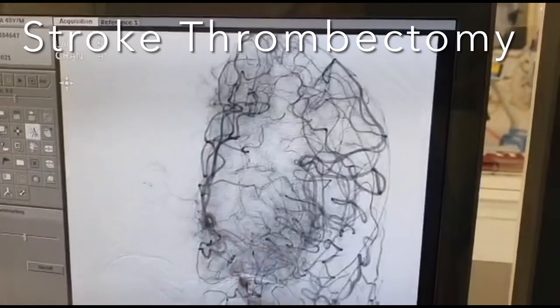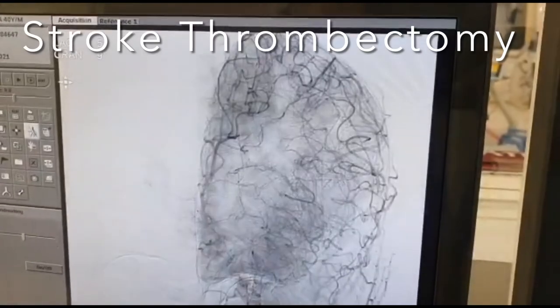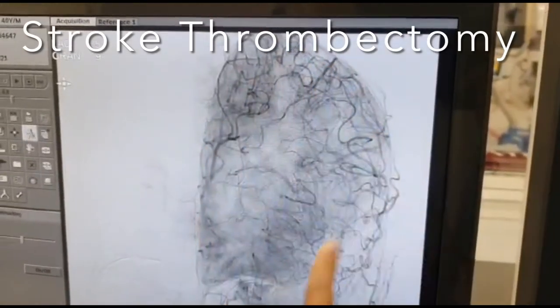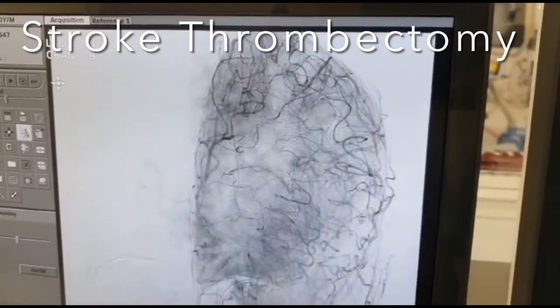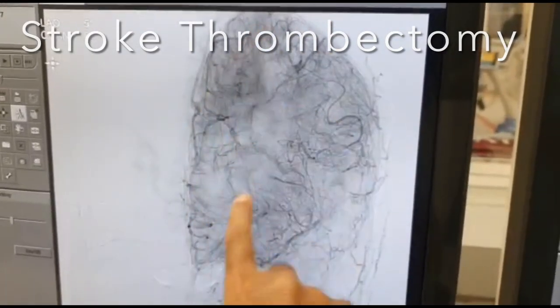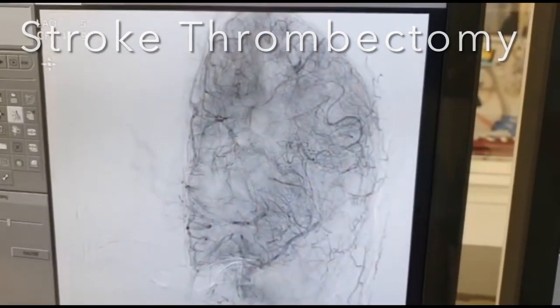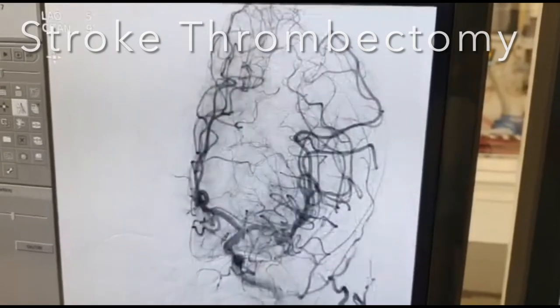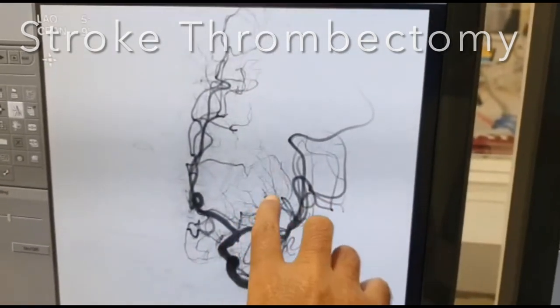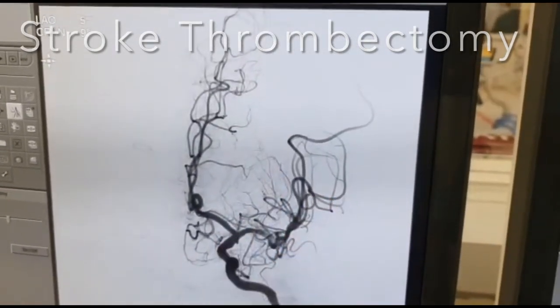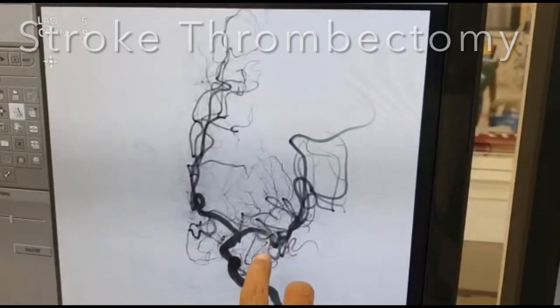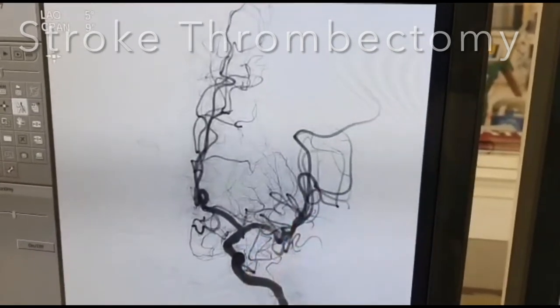Looking at the capillary phase — this is more like a perfusion scan. You can see that the whole brain, both the ACA territory as well as the MCA territory, is completely perfused. The lenticulostriate vessels can be seen very well and the M1 branches are also filling normally.